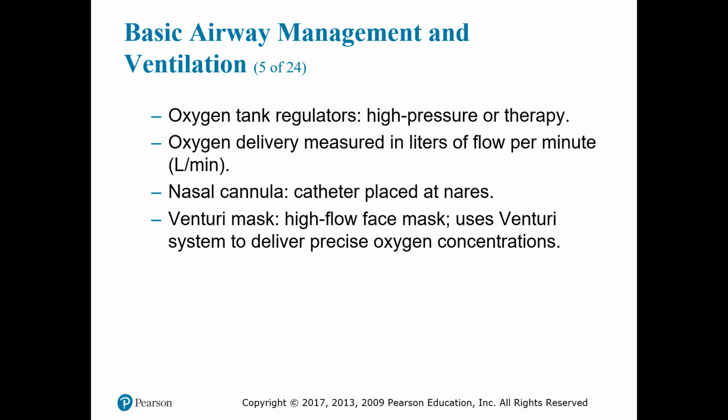The Venturi mask is particularly useful for COPD patients, where you really want to control the inspired oxygen concentration. Again, this is usually hospital and ER stuff, and respiratory therapists that do this all day long, every day, are generally the ones who use this more. If you have it on your ambulances, I'd follow your protocols as to the use and your percentages. Otherwise, it's going to fall back on your education and experience and your assessment skills on what's going to work best for your patient. You may encounter these during transfers. That may be another place that you see these, going from hospital to hospital.